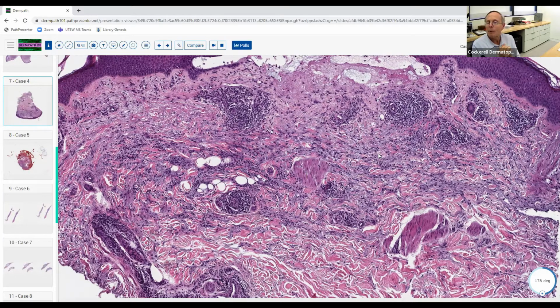So this was an interesting, slightly unusual example of interstitial GA. GA sometimes can be precipitated by trauma in some cases.